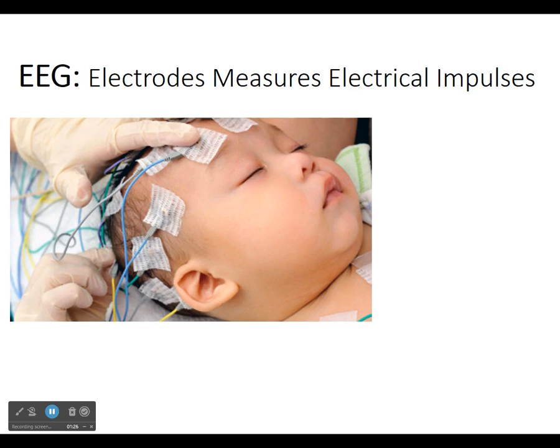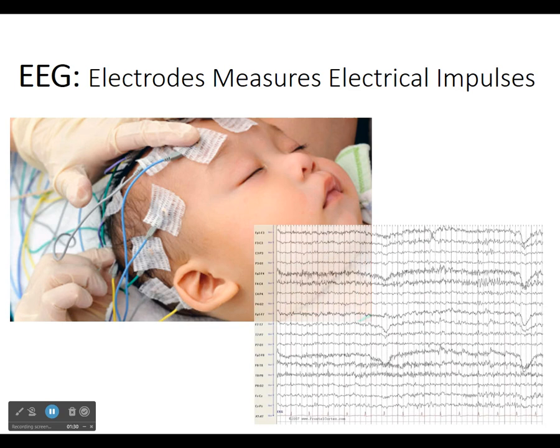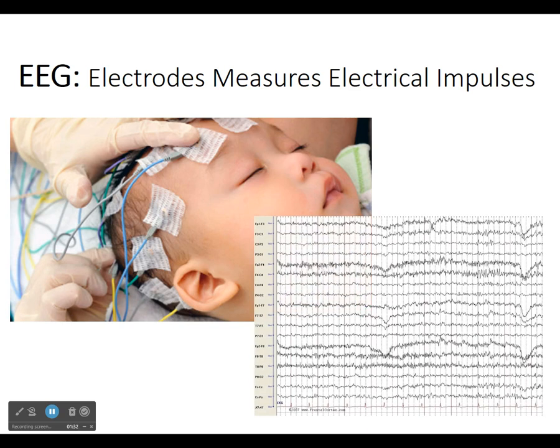Depending upon the amount of activity, we'll see different peaks within this EEG report, which looks something like this. An EEG can be fantastic if what we want to look at is brain function. But as you can see from this EEG here, it doesn't tell us anything about structure. So if you're interested in location of energy or activity, the EEG is probably not ideal.